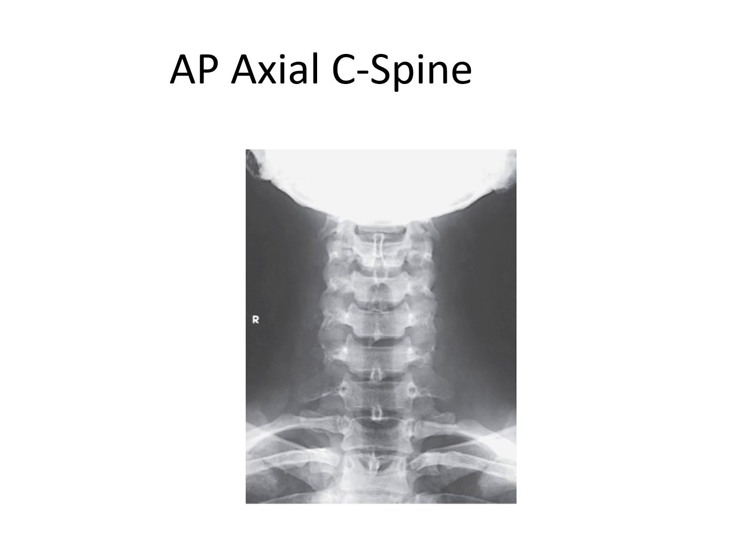This is an excellent radiograph, okay? Usually the shadow of the head, see how it's impenetrable, it's bright white? That's because you've set the technique for going through a cervical spine, not going through a head, okay? And so the head partially superimposes C2, but we can see that on the odontoid shot, on the open mouth shot. So we really only need C3 through C7, and we have those captured here. And so this is a good radiograph.